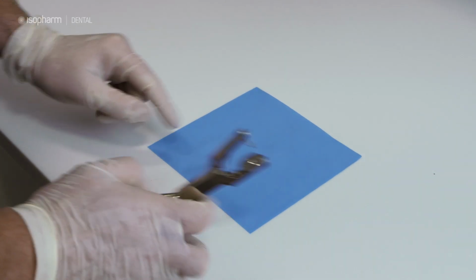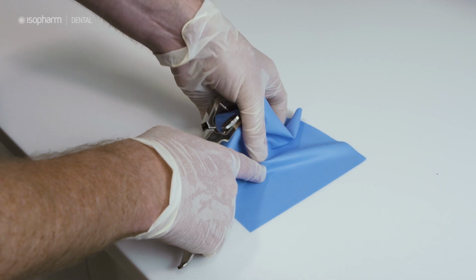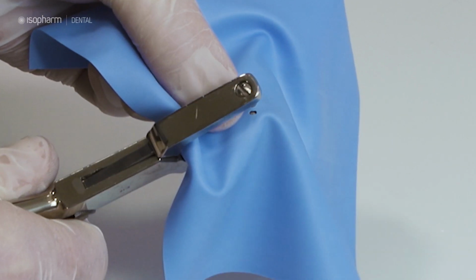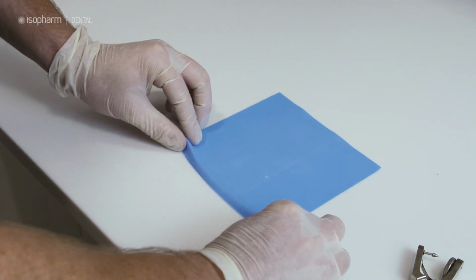The other thing to keep it really simple is where you punch the hole. There's no real need to use templates or guides if you punch the hole in the same place each time. The way I always do it is find a point in the centre of the rubber dam, move diagonally towards one corner, about an inch or 2.5 centimetres, and punch your hole in that point. Don't punch one hole, punch 3 overlapping holes, just using a medium-sized hole on the punch. That gives you a hole that's big enough to stretch over a clamp, but not so big that there's any risk of the dam tearing.